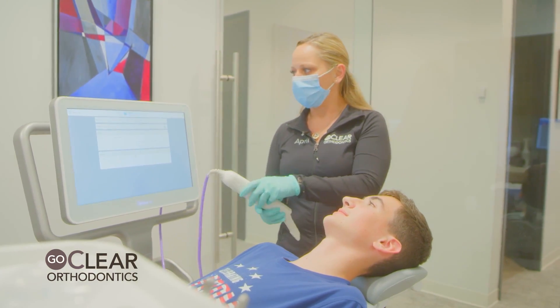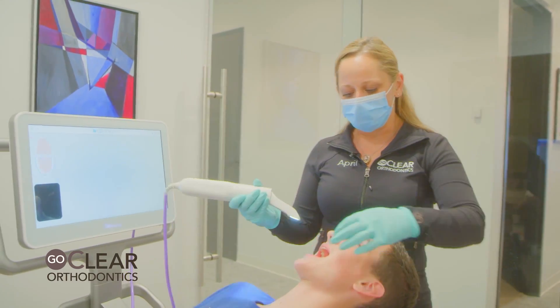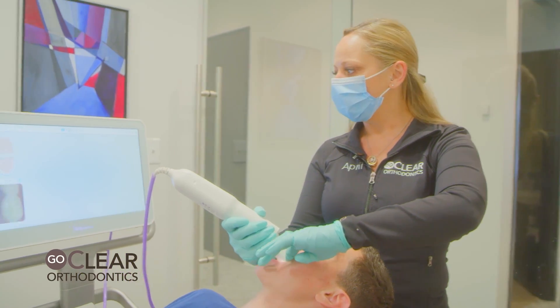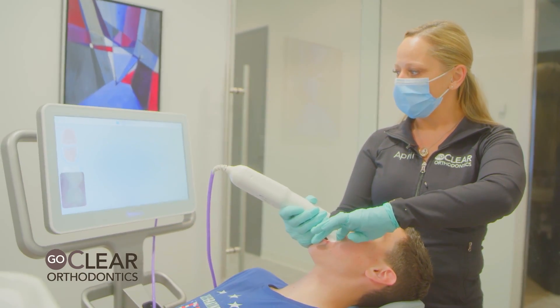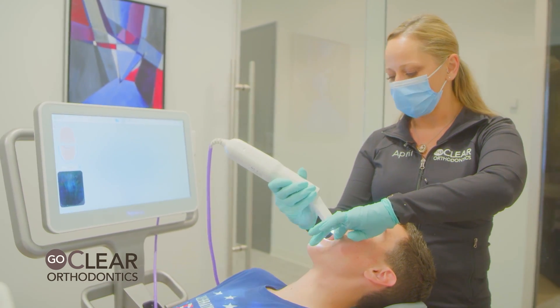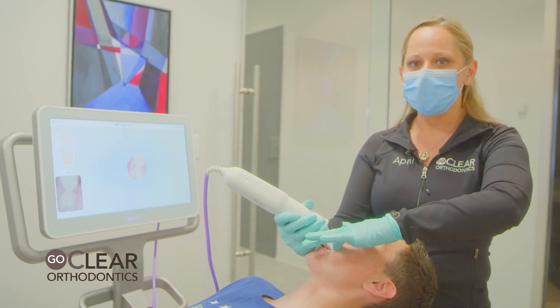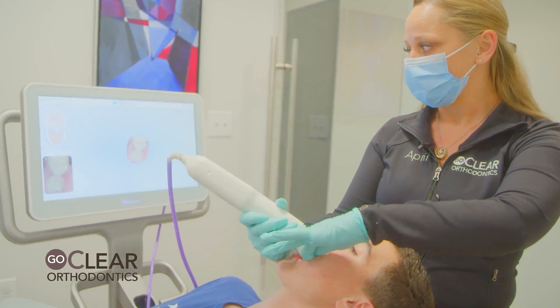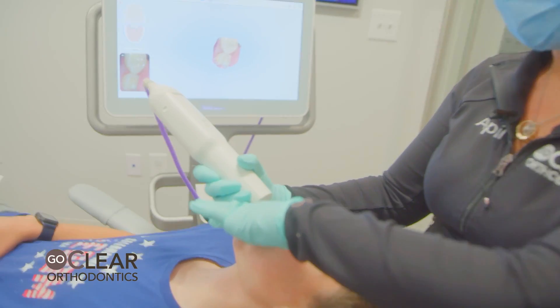We always start with the lower arch. I always start on the lower left and go to the lower right. You always start on the occlusal surface — get the wand tip in where you can see the occlusal surface before you turn it on. Once it's on, finger placement is everything. Your left hand guides this wand tip, which will get you a faster scan.